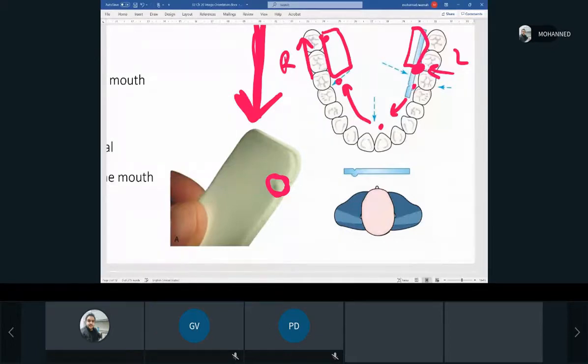So you would still put it either like this or this? No, it's always facing you, but you can either put it up or down. Right. So you have a mark on a film that you always put, we have this dot on the film, for example, right? And then we want to always keep it on top.